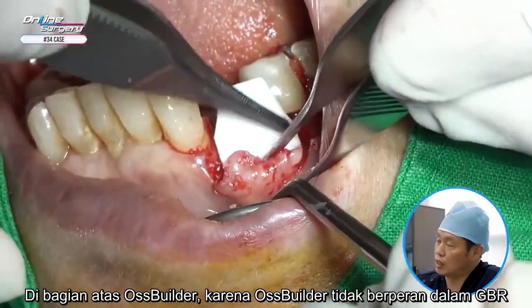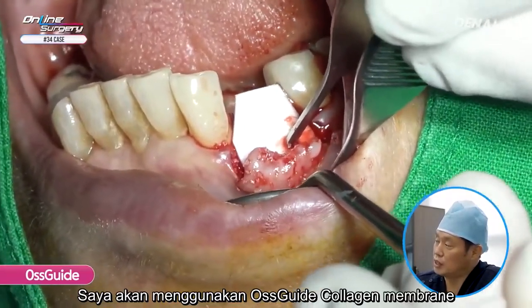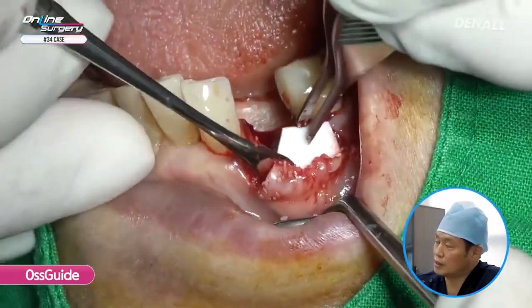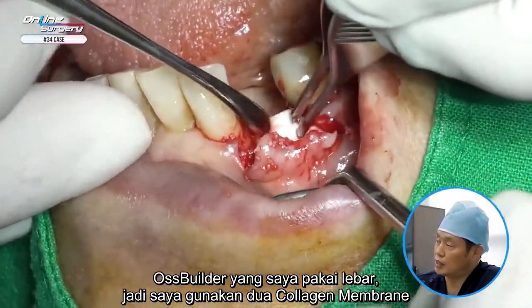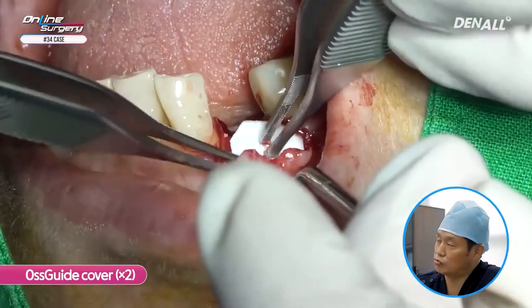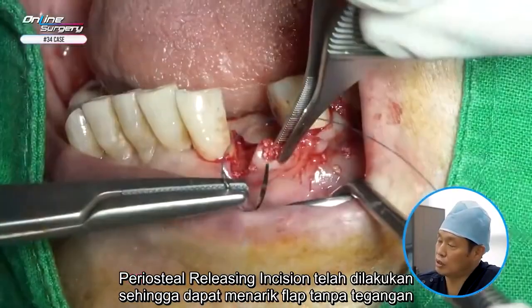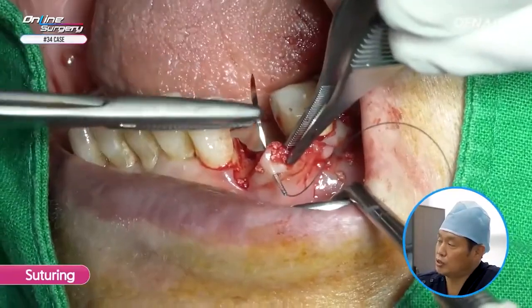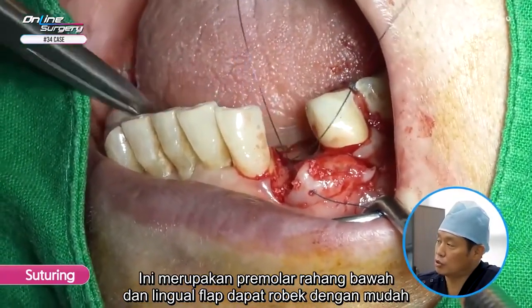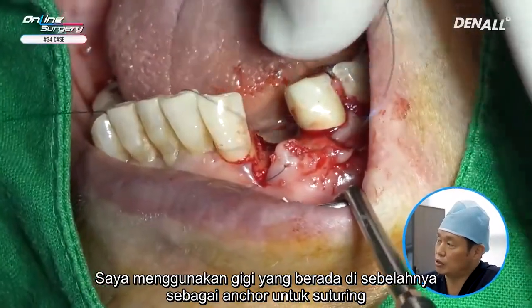On top of OssBuilder, because OssBuilder does not serve a role for GBR, I'm going to use OssGuide, the collagen membrane. I have a big OssBuilder here, so I'm using 2 collagen membranes. A periosteal releasing incision is done so that the flap can be approximated without tension. It is a lower premolar and the lingual flap can tear easily. I am using adjacent teeth as an anchor for suturing.